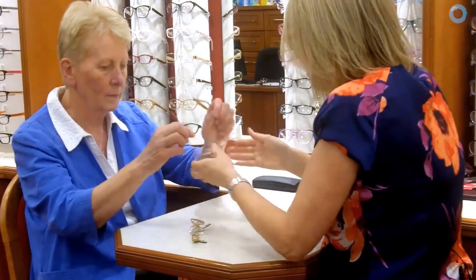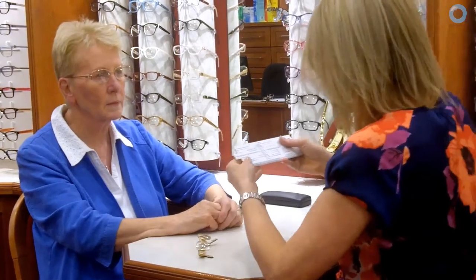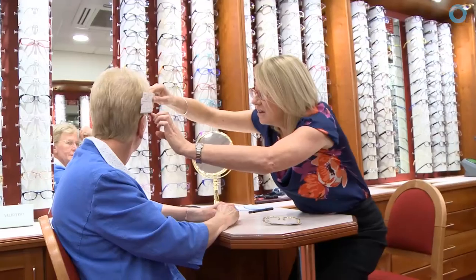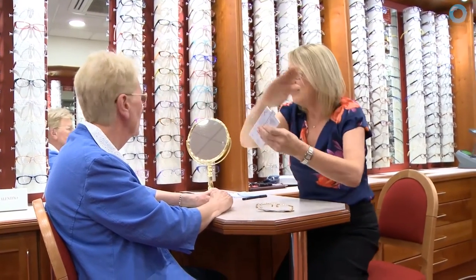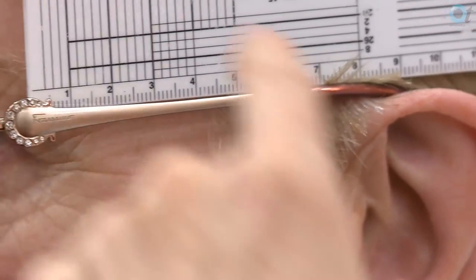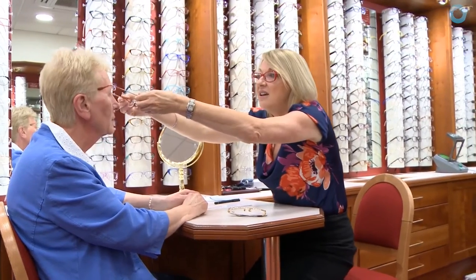If you pop those on again for me — I'd always check the length to bend. So if you could turn that way for me: I measure from the dowel point to the ear point, and again to that side for me, Mrs Charnley. That's fine. I do it for both right and left, and then I can make any adjustments necessary and also shorten the sides if required.